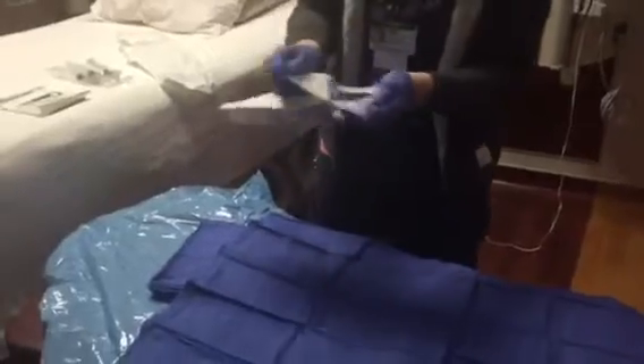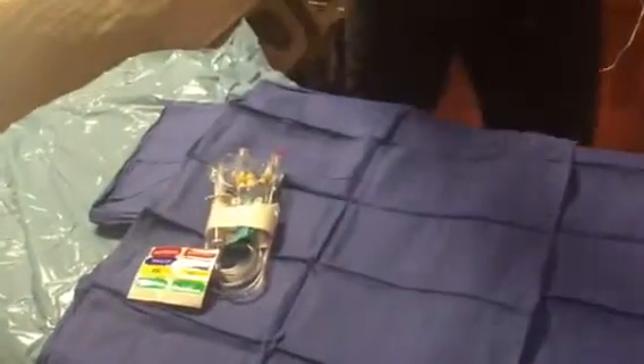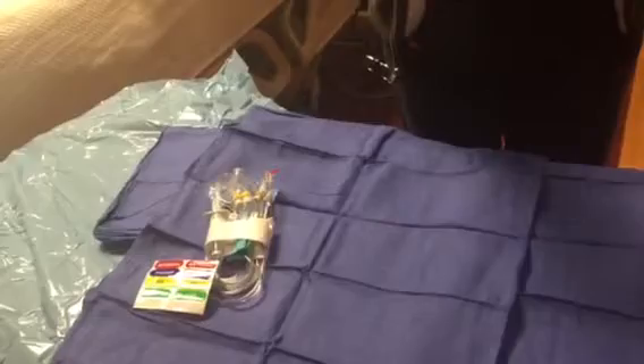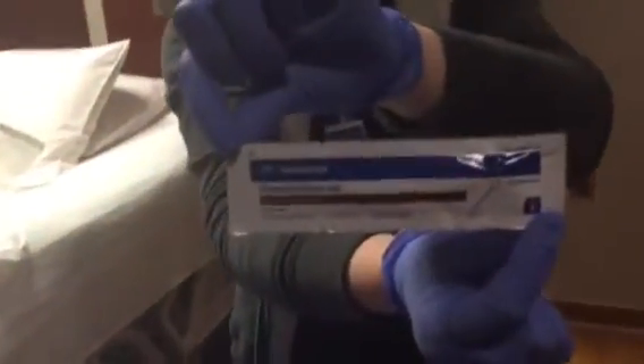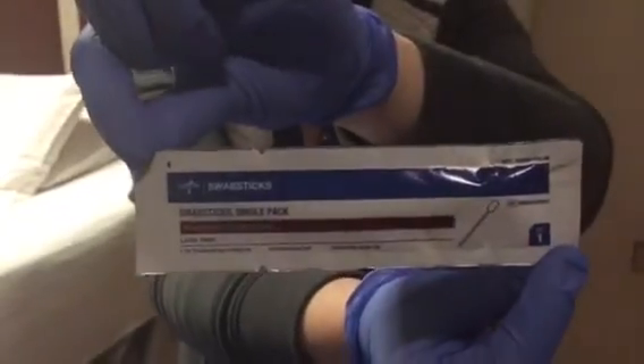This is the ventric pressure line, which is different from the pressure lines we stock in our normal store rooms, because these do not have the inline syringe for drawing blood purposes. It is being placed onto the sterile field, as this line will be entering the brain — which we do not want to get dirty. She is cleaning with iodine swabs.